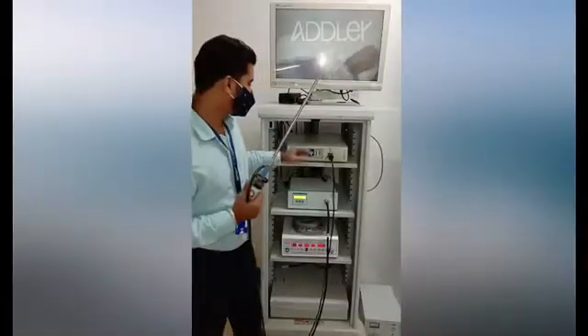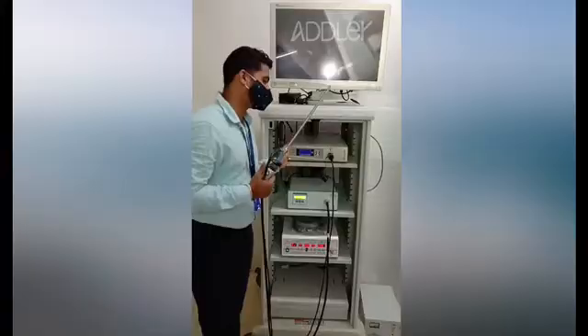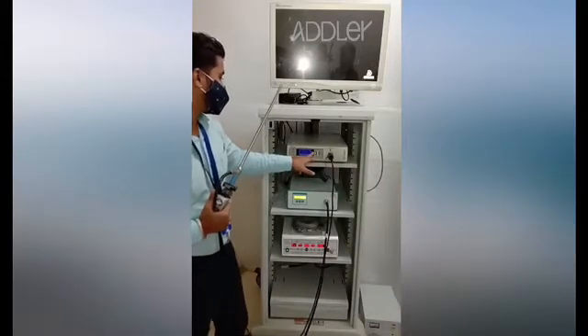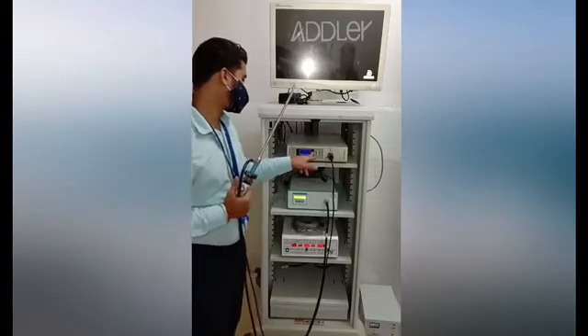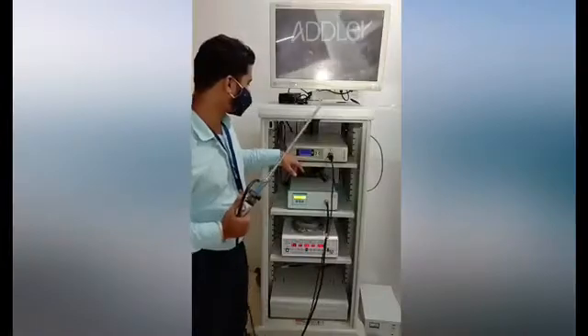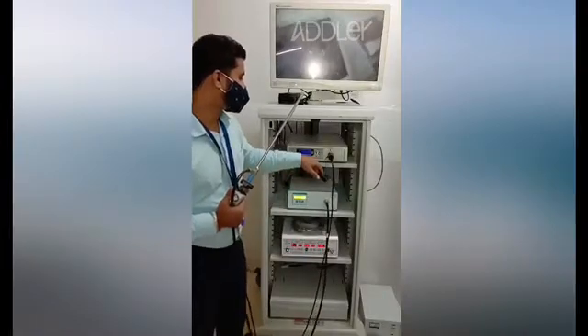Here we have the Stryker 1188 HD console, which is an economic console that comes with various modes like laparoscopy, laser, microscope, standard, arthroscope, cystoscope, ENT, flexible, and hysteroscope. You can enhance picture, click pictures, and do white balance from here.